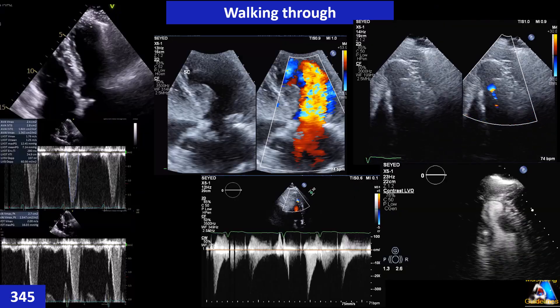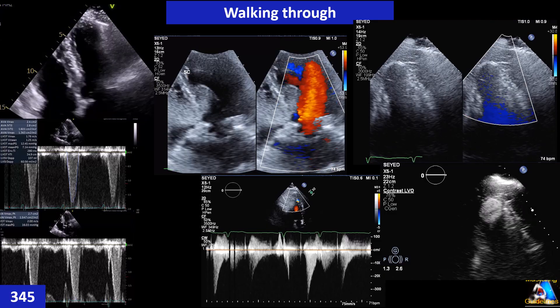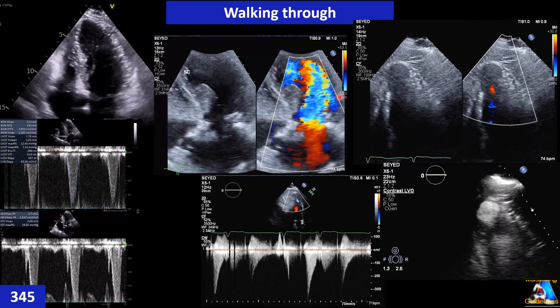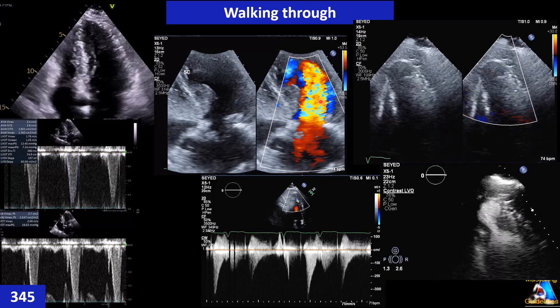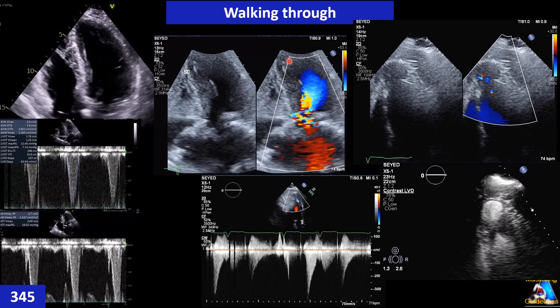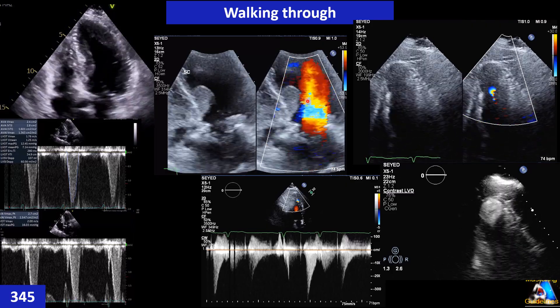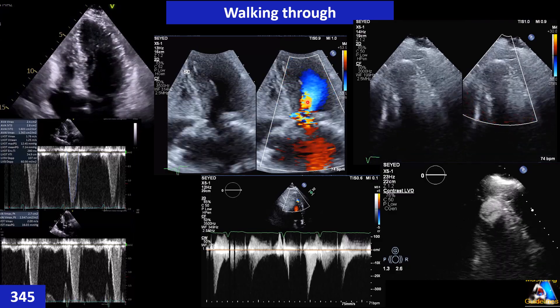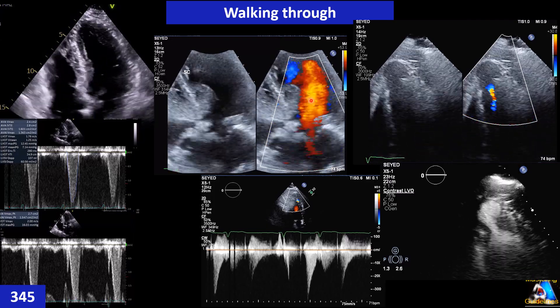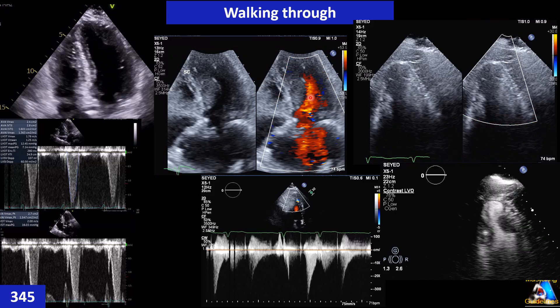The first step for performing the Valsalva maneuver is locating the obstruction. We have two options and we must do both. First, color Doppler: we can see where turbulence is, but it's not very accurate. On this case you can see turbulence here, but we still don't know exactly where the maximum obstruction is, even though on 2D we can see obstruction and turbulence at this level.